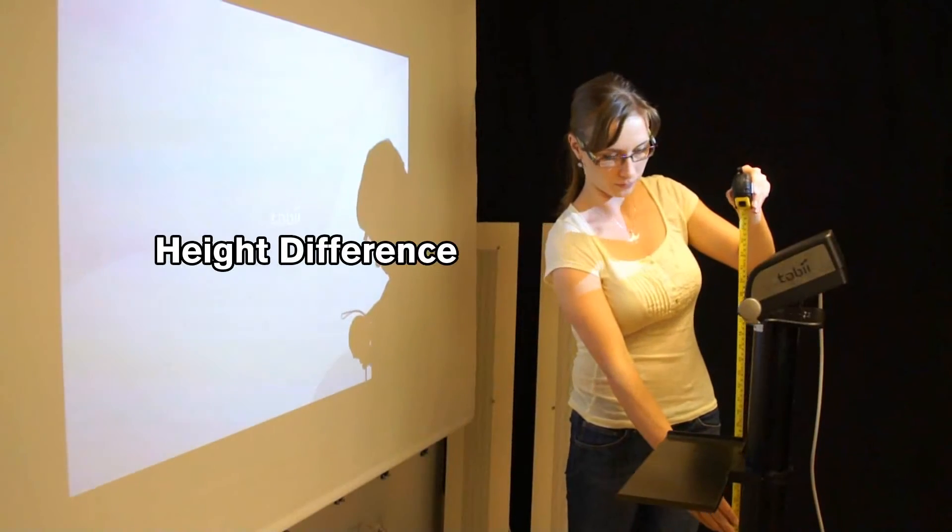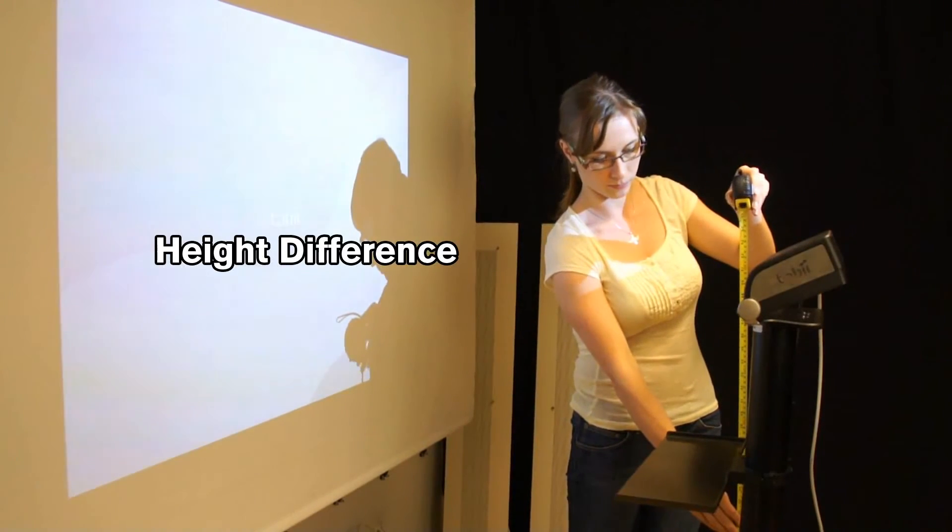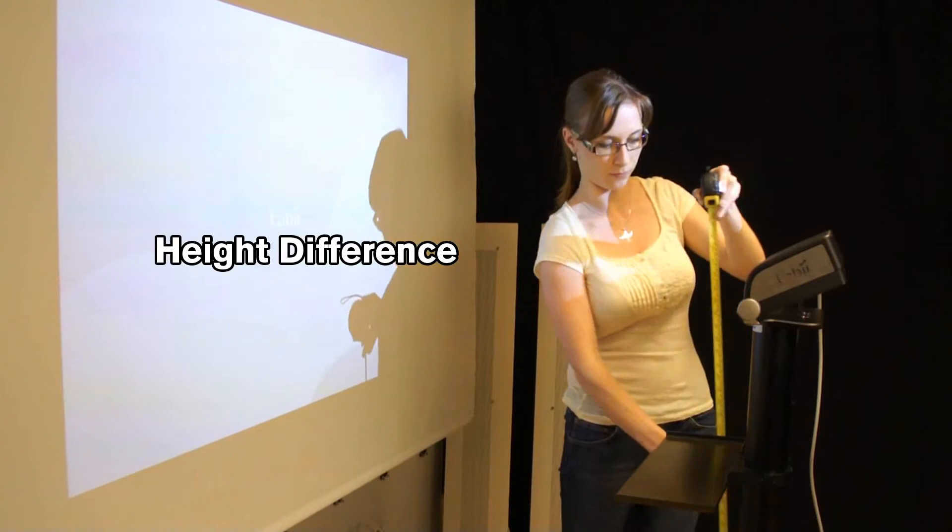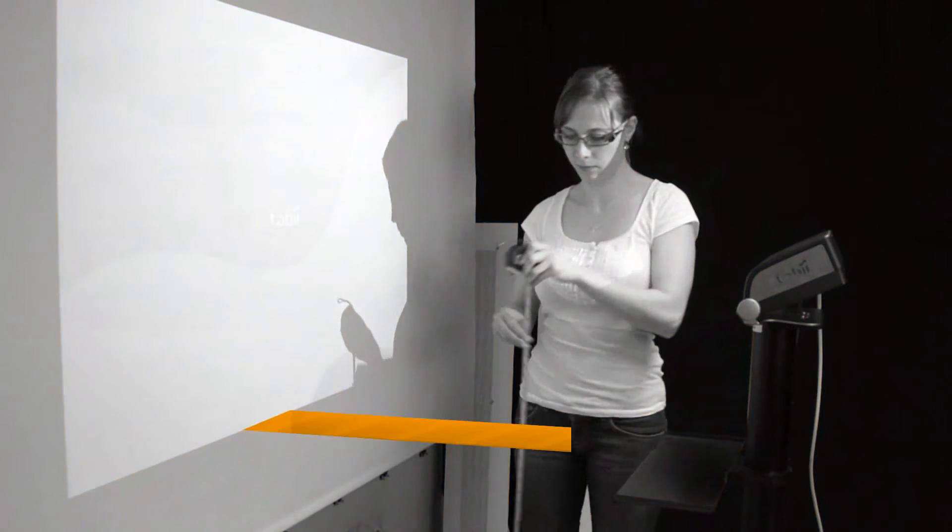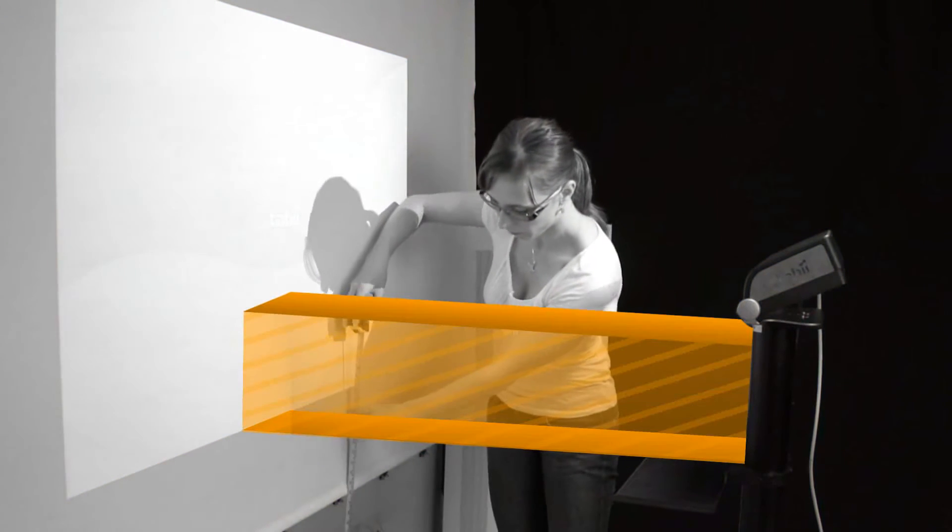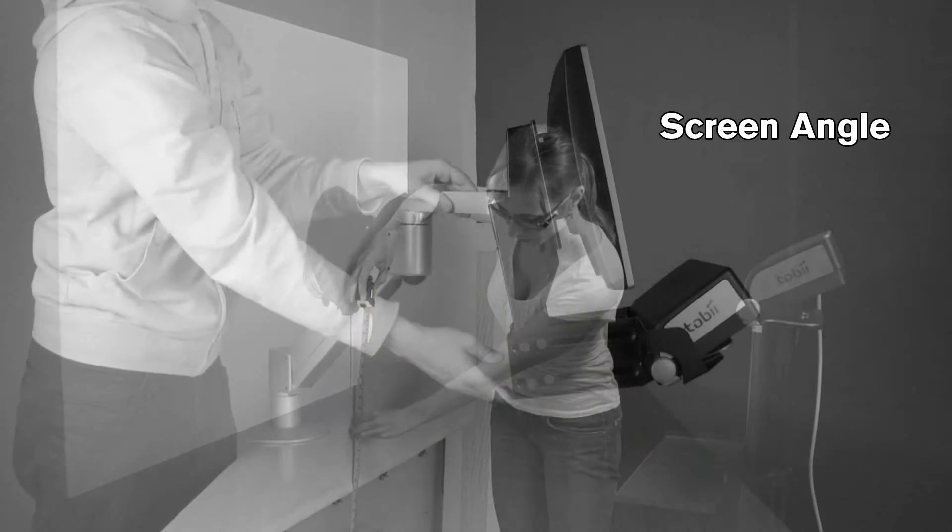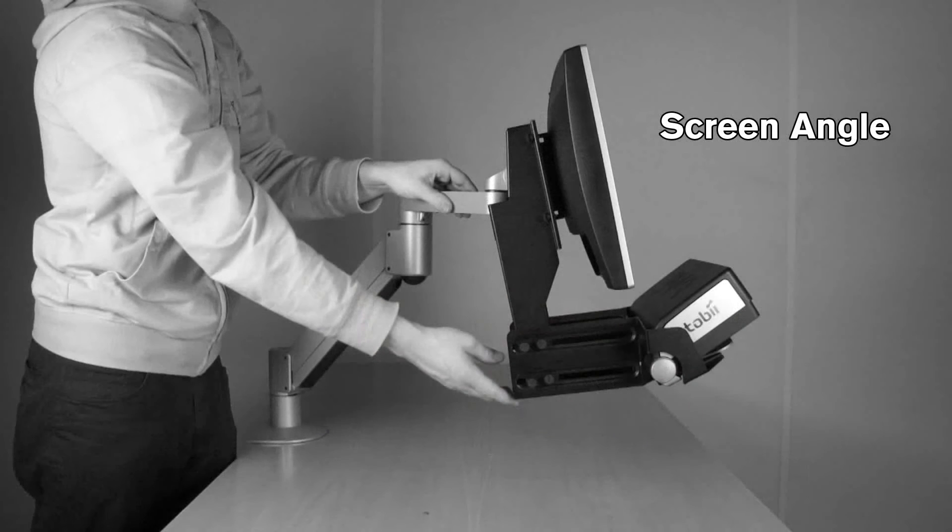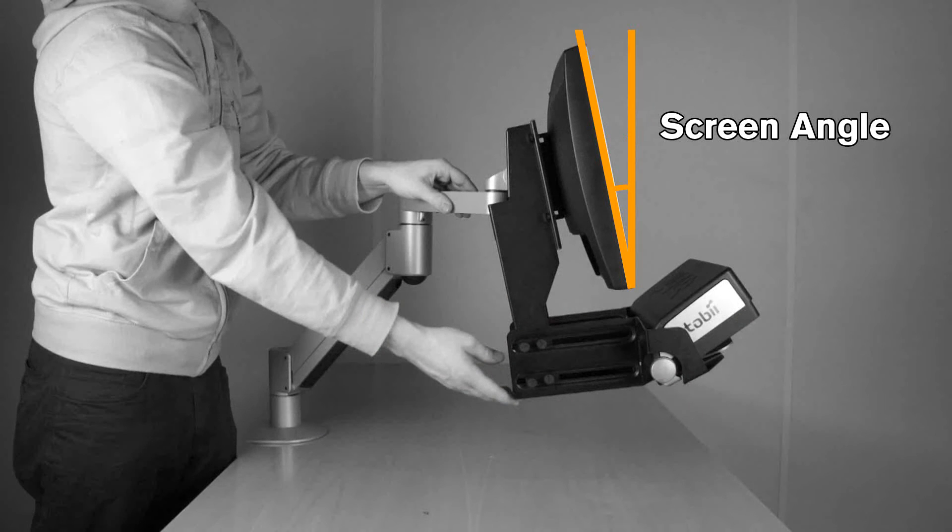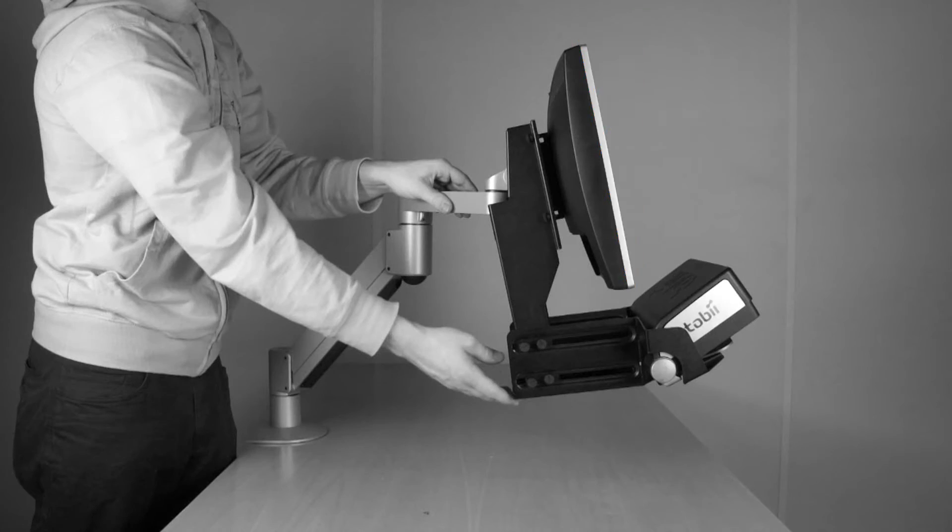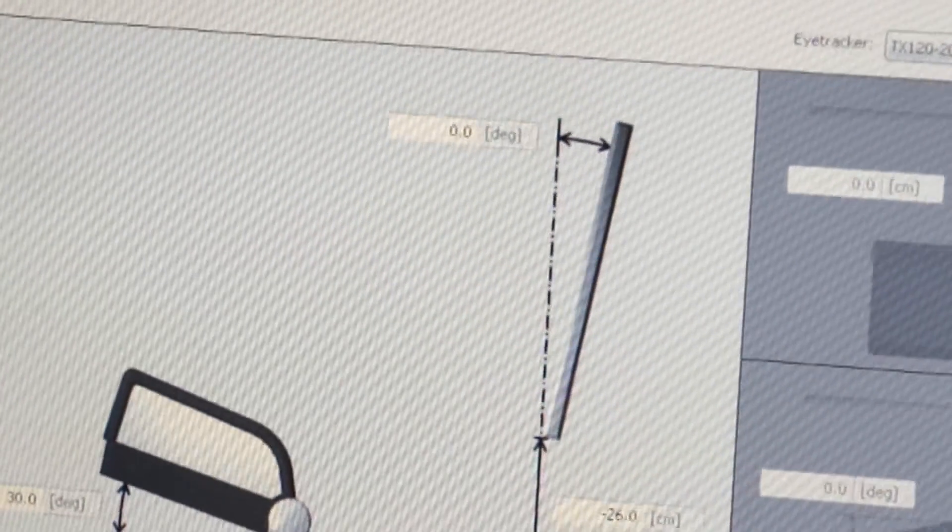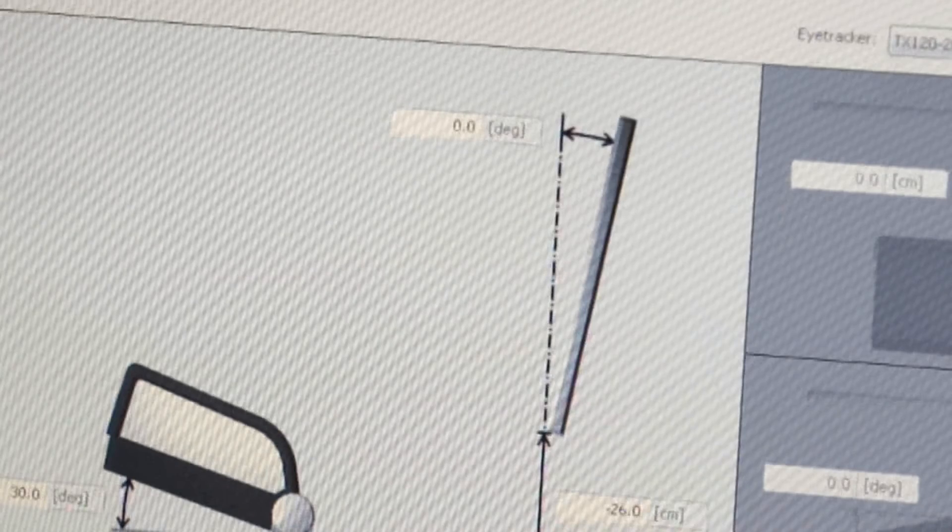Height difference between screen and eye tracker: Measure the height difference between the bottom of the eye tracker foot and the bottom of the active display area. Screen Angle: Measure the angle between the vertical plane and the visible projection. Since this setup does not use a tilted screen, the angle is automatically at 0.0.